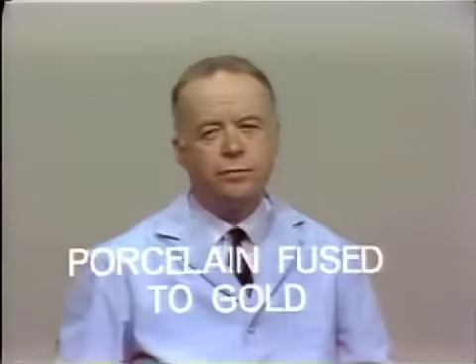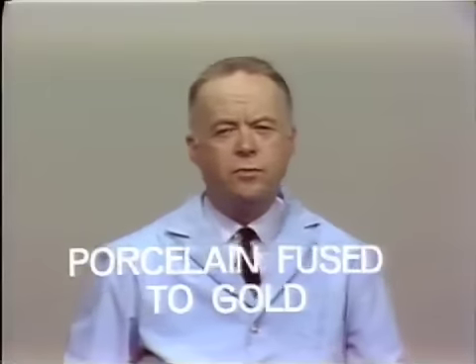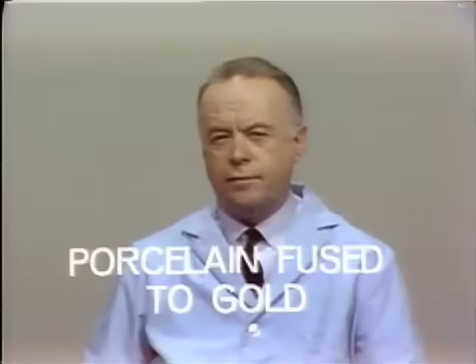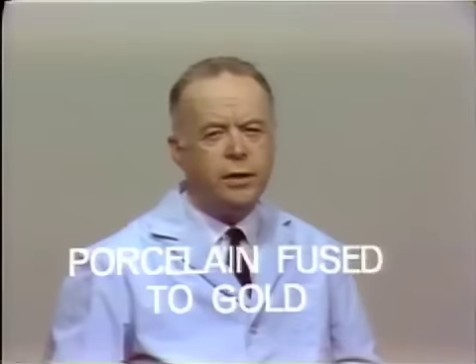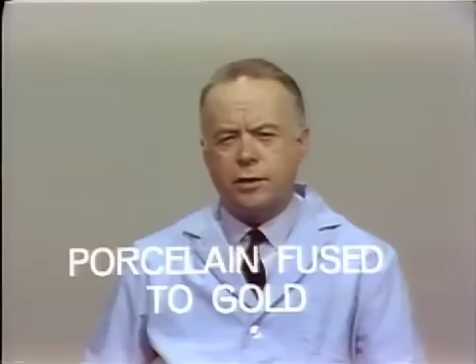A variety of systems have been developed in the last 6 or 7 years for the use of porcelain fused to gold on bridge Pontics. These techniques offer the advantage of giving almost complete coverage of gold and the potentiality of excellent aesthetics in these situations.